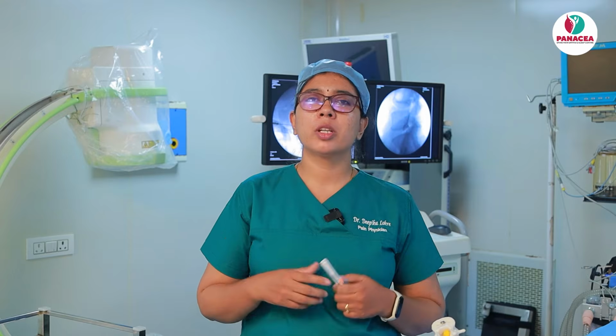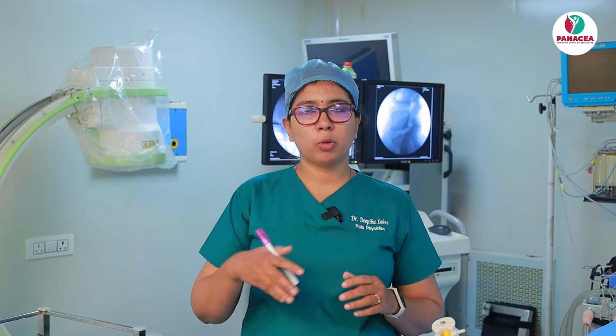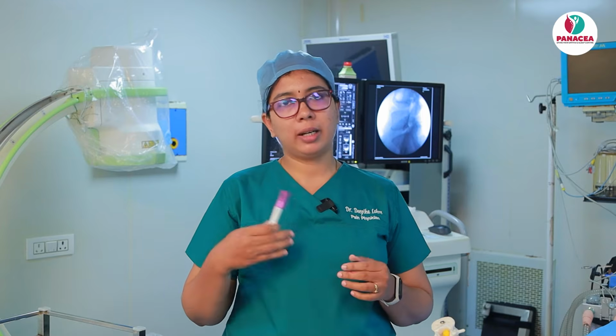Then a dreaded complication, as I said, going into the spinal cord and giving the drug, which is very rare. Usually spinal cord injury with the transforaminal approach is rare because you have to be very medial, and if you have gone too oblique and you are going too medial, then it might happen. Very rarely does it cause any spinal cord injury, but it can happen. One of the rare complications.